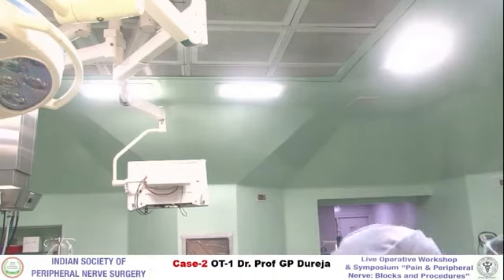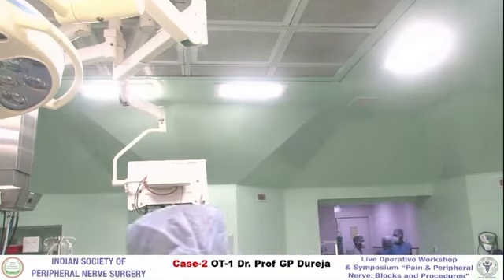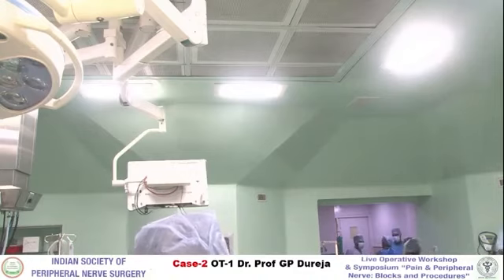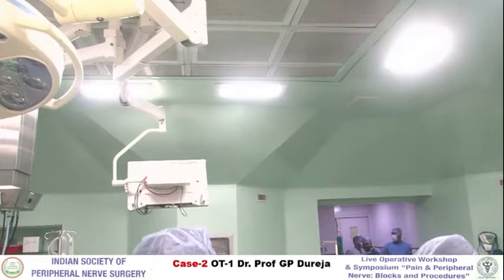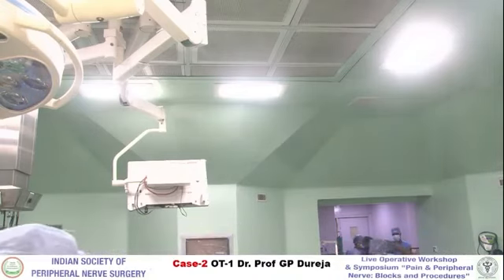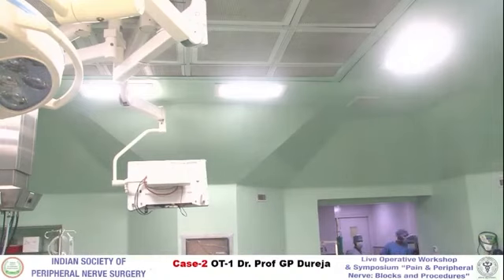Now, there's a difference between this machine and the one that I have. It's not continuous stimulation. In that machine, there is a point stimulation. So when I push the pedal, I'm able to see the jaw. Like I've also shown in my clip that the lady's jaw was opening when I was giving a test stimulation.